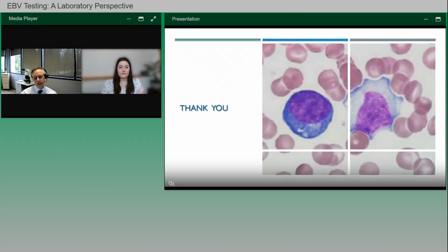So the diagnosis of that chronic active EBV is by PCR. They use confirmation using PCR, and they want to see a pretty high copy number, something like greater than 10,000 IUs per mL has been proposed. And some protocols will also want to detect actual cells, actual T cells or NK cells that are EBV infected.